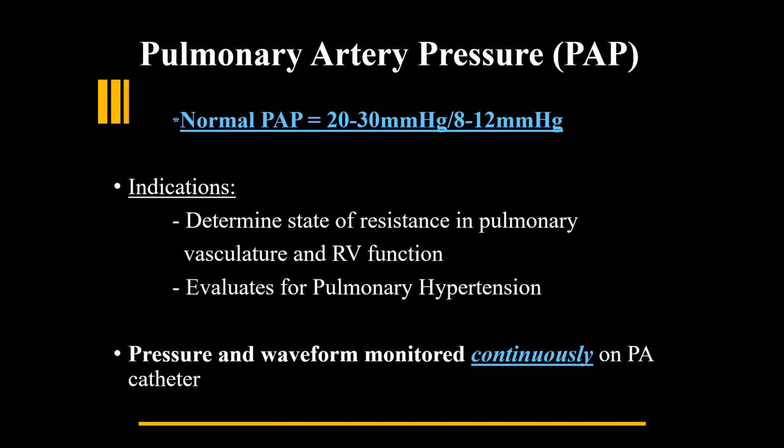So a pulmonary artery pressure has a systolic, that's this top number, 20 to 30, over a diastolic. I will say this one more time. It is not a blood pressure. Do not get blood gases from this. This is not arterial blood. But it tells me the amount of pressure within that pulmonary artery. And that's important to know because we have a lot of patients with pulmonary hypertension. And we'll see these crazy numbers, like the highest I think I've seen is like 70 over 40. High amounts of pressure within the pulmonary artery.